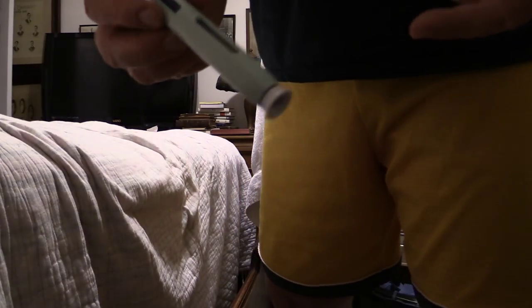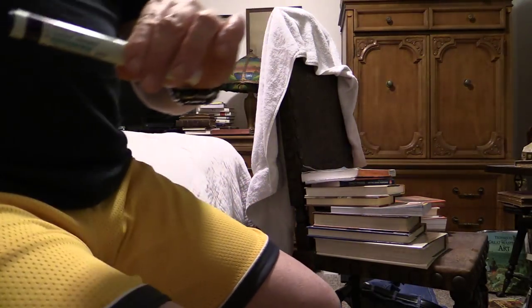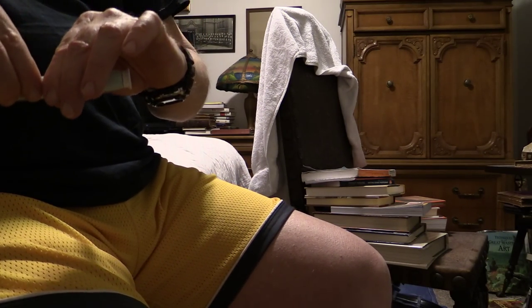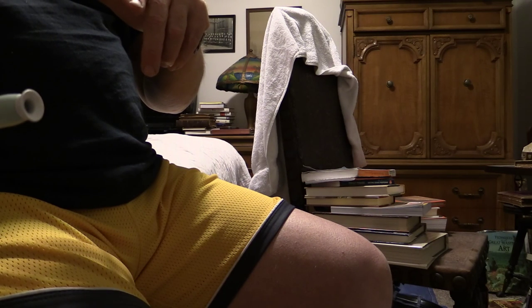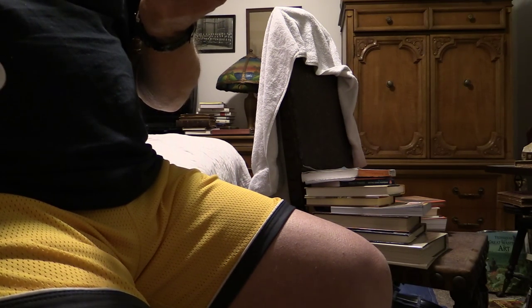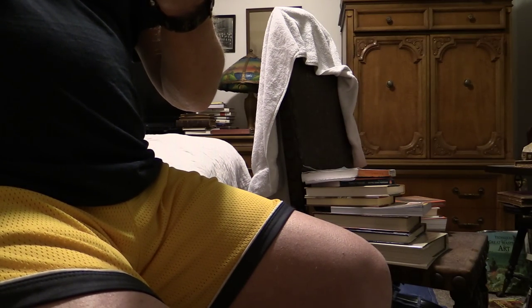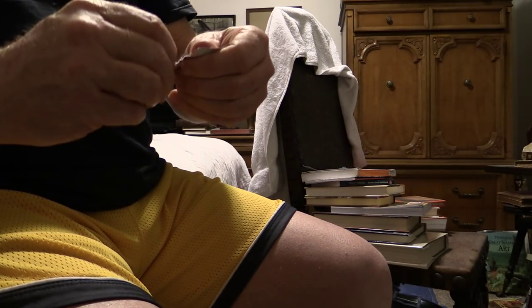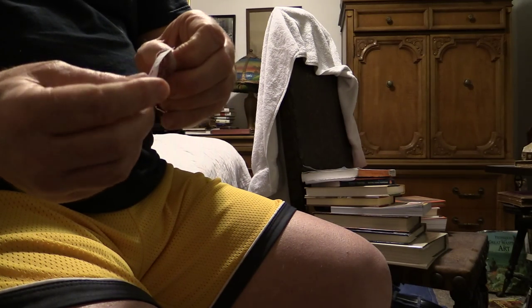So wash your hands thoroughly. I set the pen down on the bed. When you first start doing it, there are certain things you wish you would have done a little differently — one of those was getting a band-aid. I didn't really need it with Humira, but it's a good idea to cover that puncture wound. If you look at some of the complaints with regard to these biologics, it's at the injection site. I've never had a problem. I can't even tell where I've injected myself most of the time. Then I get an alcohol swab, which you don't get with these Enbrel pens — you got them with Humira — but you want to make the area as clean as you can.